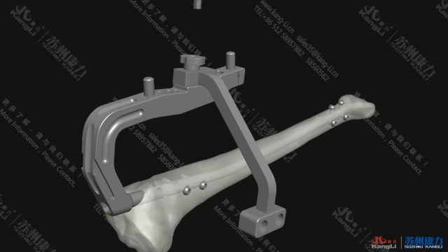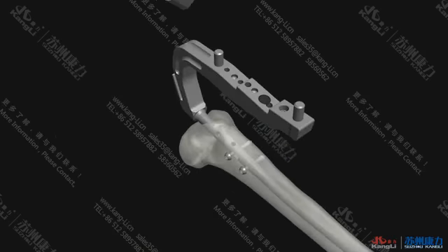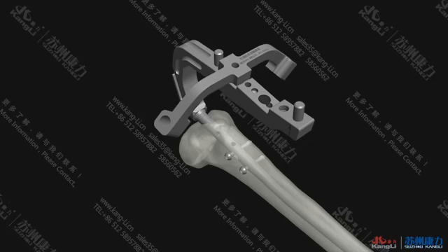Three phi 5.0 locking screws could be placed at the proximal end of the nail of the KTO Tibial intramedullary nailing system, according to the requirements of the type of the fracture. The detailed operations are as follows. Install the proximal cancellous bone targeting bracket on the holder and screw tight with the proximal targeting bracket lock wheel.